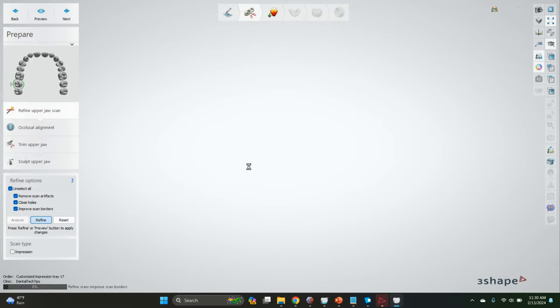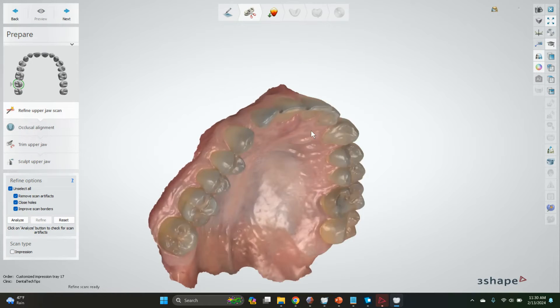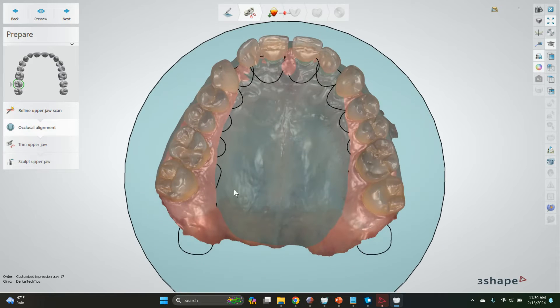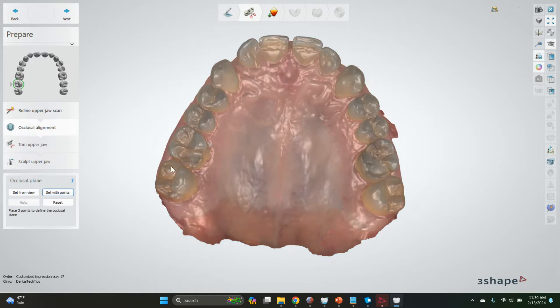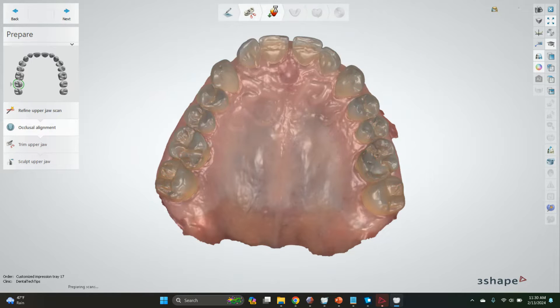We can refine scans - we have a minute to do that. Alright, set the occlusal plane. It's a very nice looking scan actually.